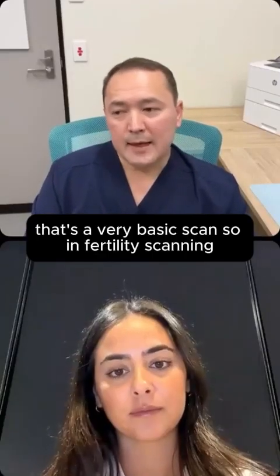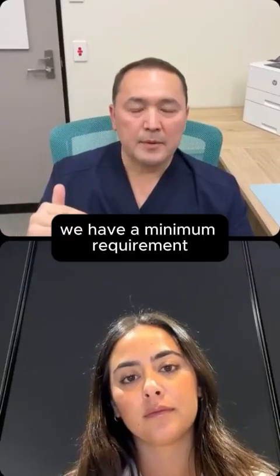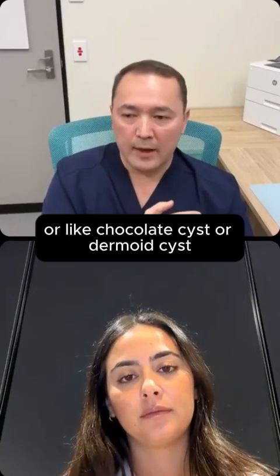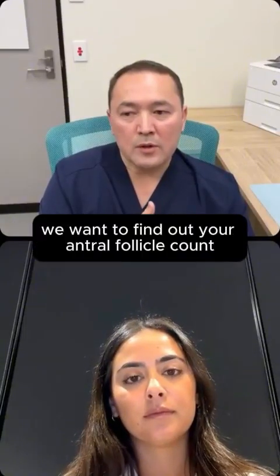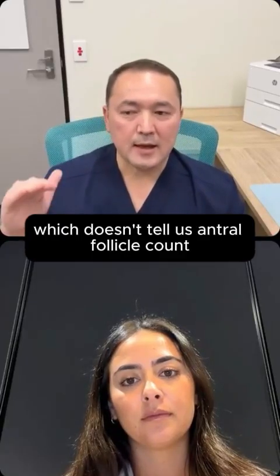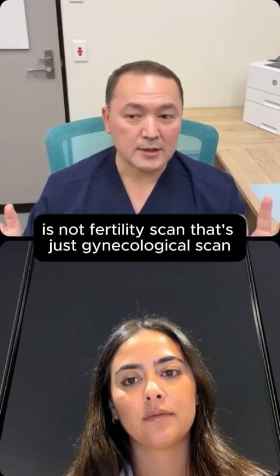In baseline fertility scanning, we have a minimum requirement. The minimum requirements are to diagnose any ovarian pathology like ovarian cyst, chocolate cyst or dermoid cyst, and also to find out your antral follicle count. Any ultrasound scan which doesn't tell us the antral follicle count is not a fertility scan; that's just a gynecological scan.